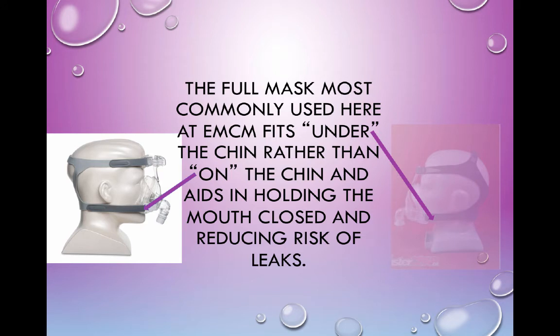You're going to see that these are both full masks, and you'll see a couple different ones. I'm pointing this out; really, this is specific to this place. If you look at the one on the right, it kind of goes below the chin. So most full masks go over the nose and come across here. Ours actually go underneath. It has kind of a wraparound, so it kind of holds the mouth shut.